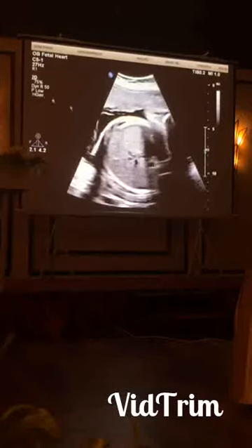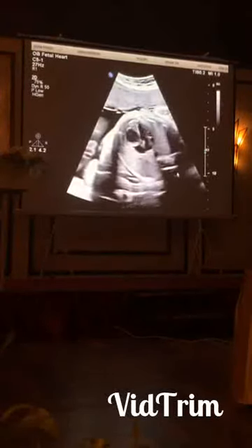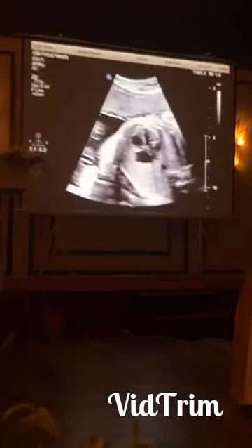This is the left side here. This is the right, stomach, aorta, and then you see the motion review. And what is the obvious here?